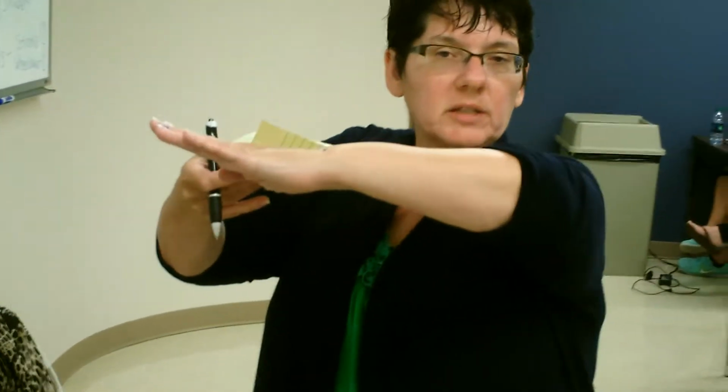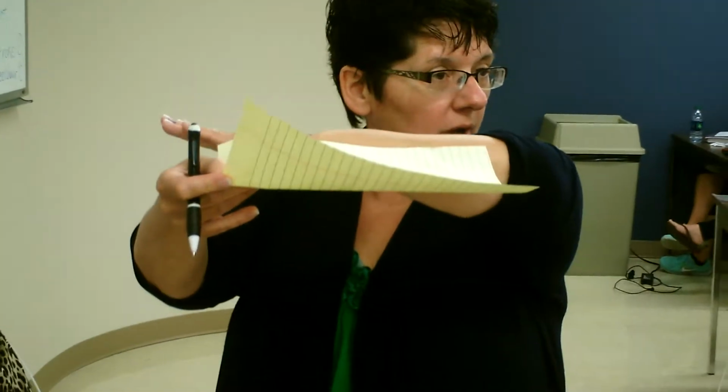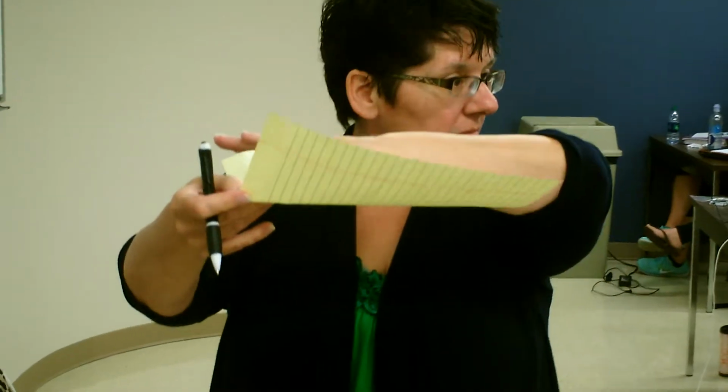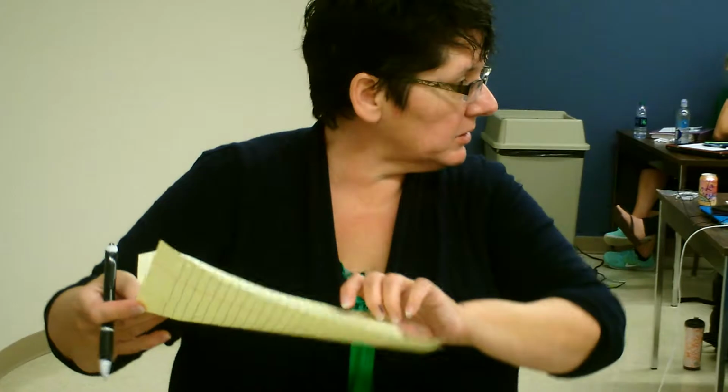Now, typically on the video, come out about 3/4 of an inch from their arm, because a splint is supposed to go up halfway on the sides of the forearm, okay? If it's too shallow, they're going to tip over the splint. Does that make sense? All right? Are we good with this, friends?